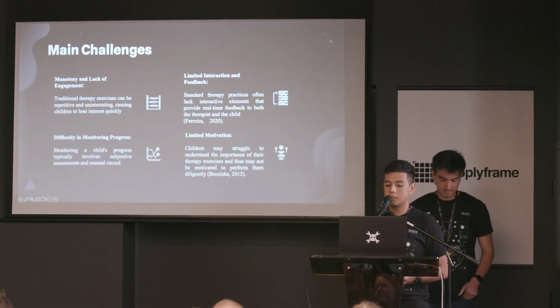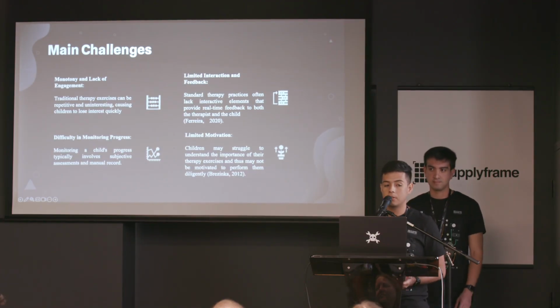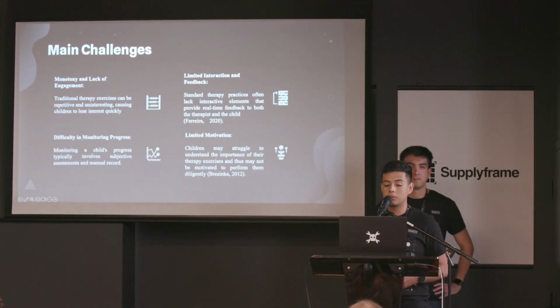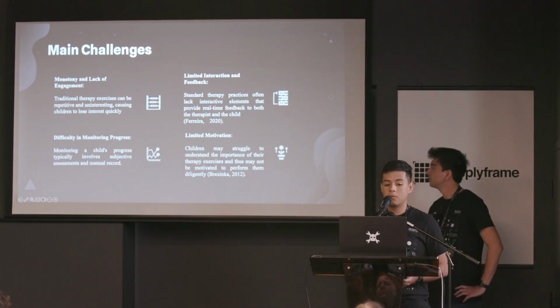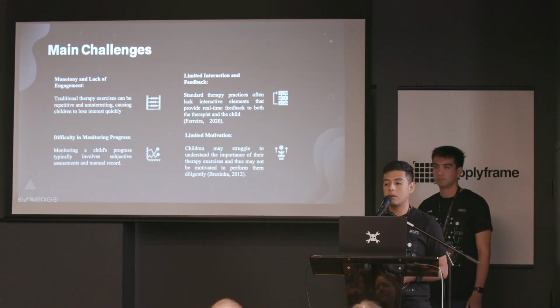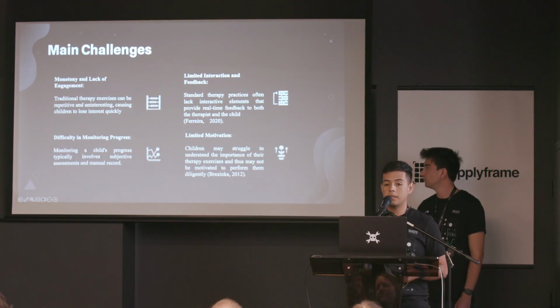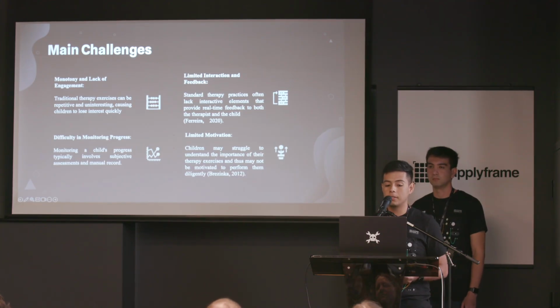So the main challenges we found was, in the traditional therapy, there is a lack of engagement for the children and for the user because they are so repetitive, and we wanted to solve that. Also, there is not a real-time feedback for the user, and the data that they acquire often is lost in time. And we wanted also to increase the motivation of the user.